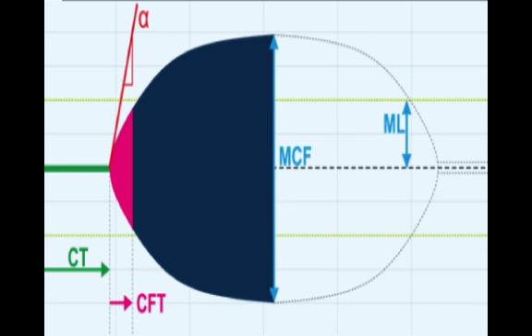And this gives us our alpha angle, which you can see in red. The alpha angle is what we use to look at platelet function, and along with that, fibrinogen to some degree. Everybody remembers from the clotting cascade that the first thing that starts to form in clot formation is essentially some platelets binding together and aggregating. We'll get back to more on that later on.